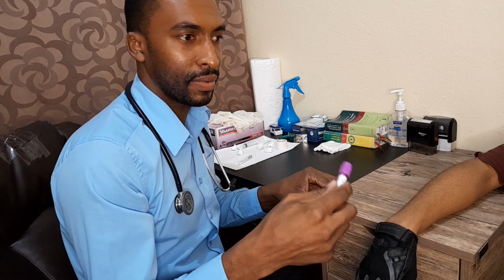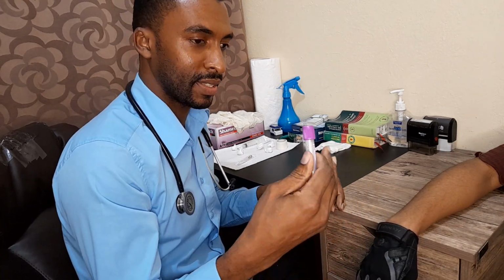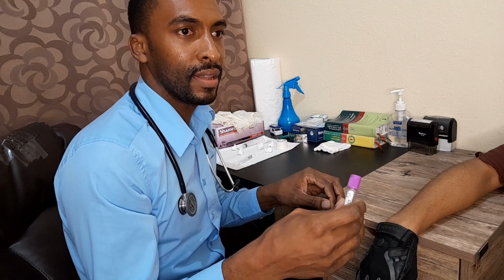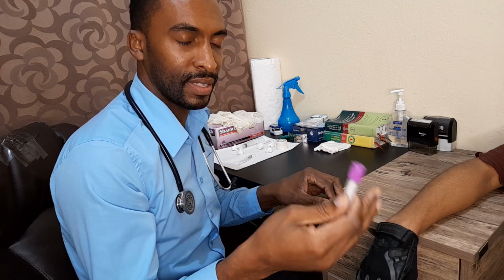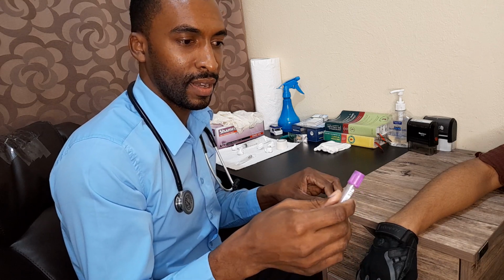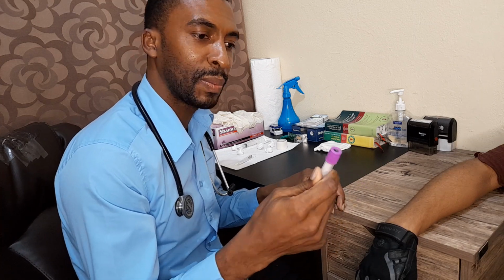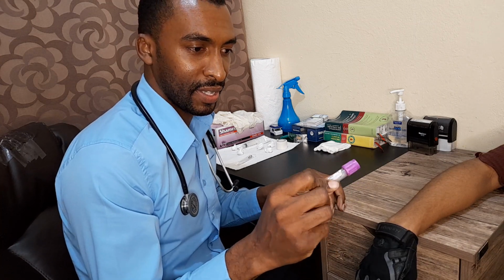to check if a person is anemic, right? Because we know that, for example, young females who have a regular menstrual cycle and are probably not eating properly can run deficient of the iron, which is normally required to make hemoglobin. So it's actually a purple top tube we use to test for the hemoglobin.